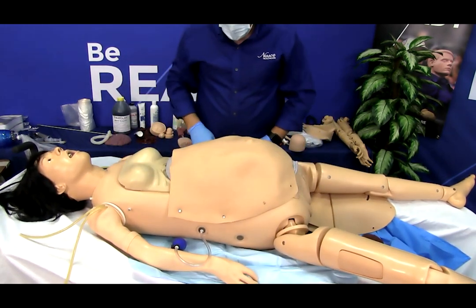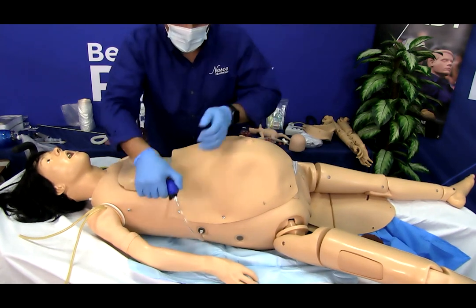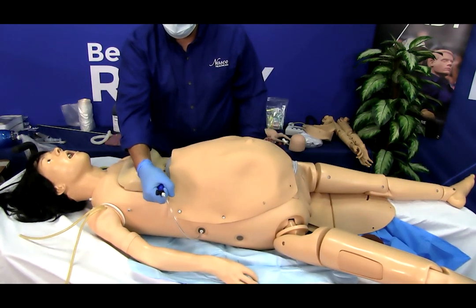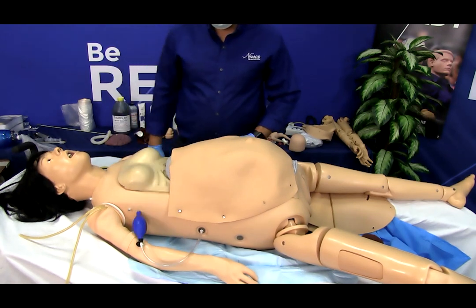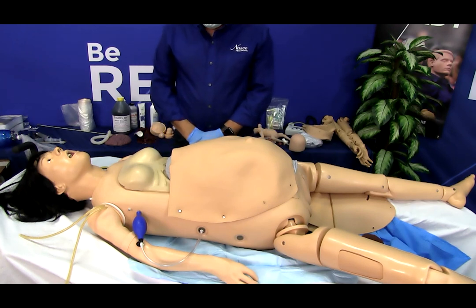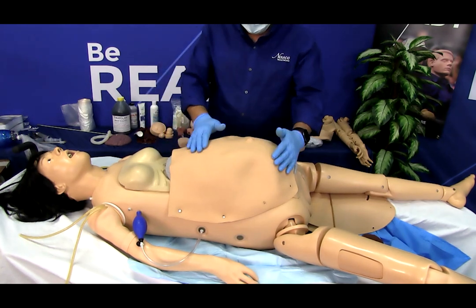Close the valve on the air pump and inflate the bag as needed to adjust the fetal position within the abdomen. Remember, do not overinflate. The bag can be deflated slightly to enable the articulating fetus to drop beneath the pubic bone.